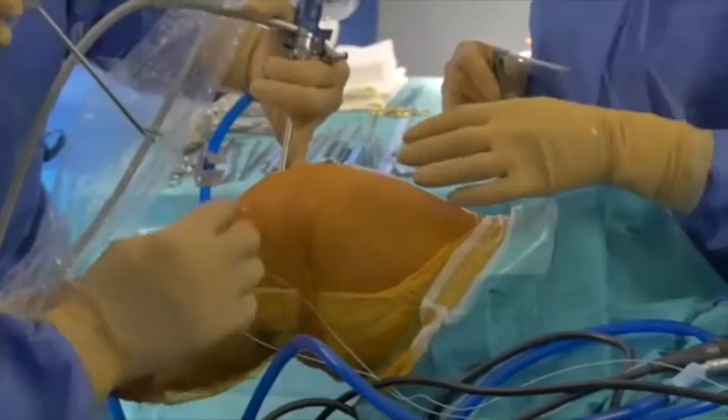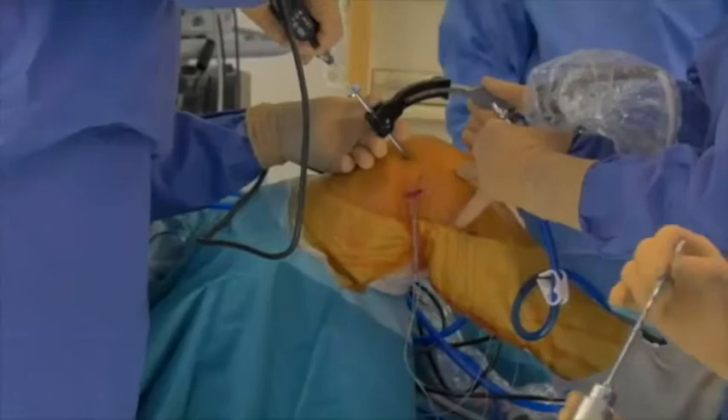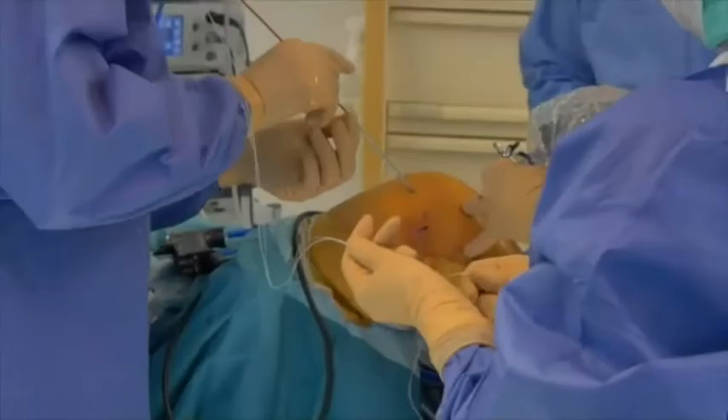An outside-in femoral guide is inserted through the medial portal and held in position at the femoral footprint of the ACL. A guide wire is passed through the guide, which is then overdrilled using a 4.5mm cannulated reamer. A fiber stick with fiber wire and tiger wire is placed through the femoral tunnel and retrieved out the anteromedial portal.